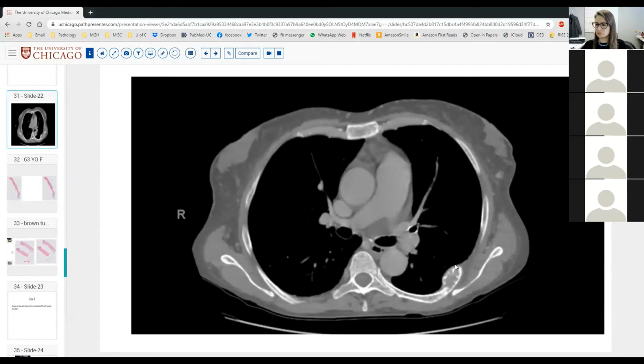Here we've got a nice cross section from a chest CT. You've got the heart over here, lungs over here, obviously, and in the 6th rib on the left side, you see this lytic lesion that appears to be buckling the bone. This has a fairly broad differential that ranges all the way from a giant cell rich lesion or something along those lines, and of course you want to exclude the possibility of some kind of metastatic cancer too, although that's a little bit less likely.